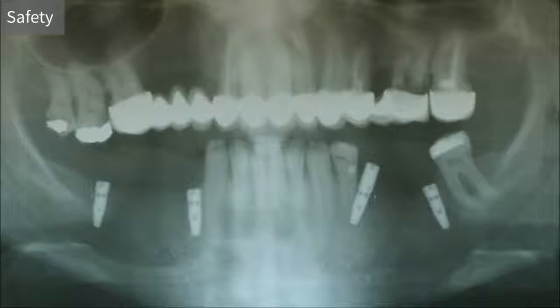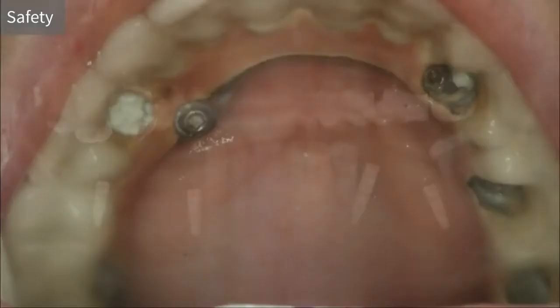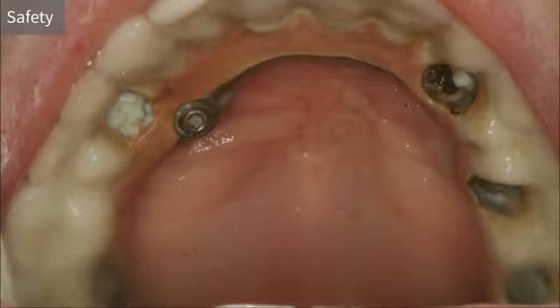Here, for example, you see a malpositioning of an implant in position 35. This minor mistake, we would say, led to a tooth extraction, then implant extraction, bone augmentation, re-implantation, and basically it prolonged the procedure by almost a year, and also added a lot to the expenses. Here in the next picture is also a malpositioning of the implant, which makes life pretty hard for the patient. So it has to be replaced, and also the prosthetic part had to be remade, which adds a lot to the cost as well.